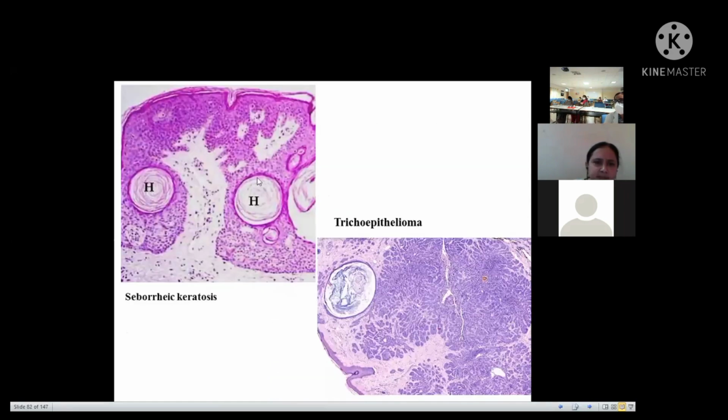So this is the seborrheic keratosis horn. It is lined by basaloid cells, and it is within the epidermis. Whereas the keratin cysts or horns in the adnexal tumors are usually in a dermal location, and they can have both basaloid as well as eosinophilic cell lining.